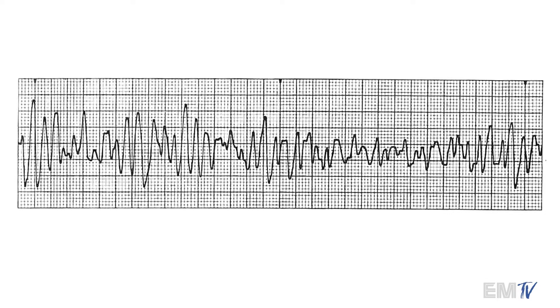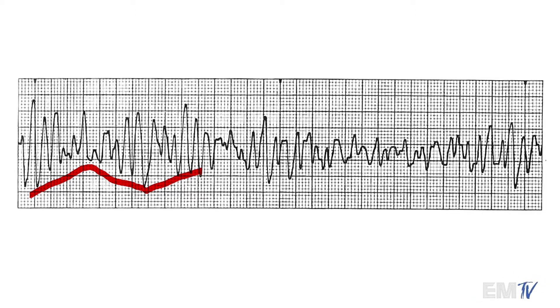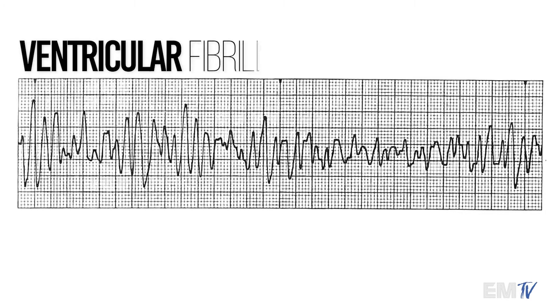Now I know that there are some elements here that may appear like it's torsades. You'll notice that there's a little bit of that twisting movement here, but with torsades you have to remember that the twisting of the points — that flipping of the axis — is very, very consistent and predictable. In this one there's no semblance of regularity to the rhythm, so this is v-fib.